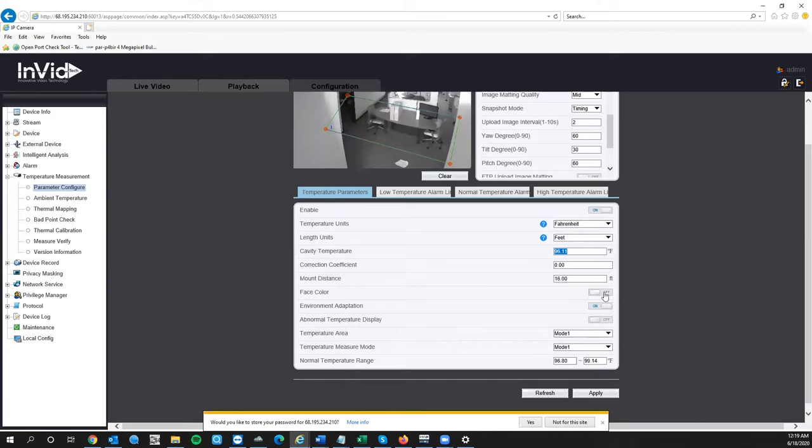Face Color will show color in the thermal lens — when someone walks in you'll see color on the face indicating heat levels. You might want to turn that on. Normal Temperature Display shows low temperature readings — we recommend leaving this off. Anybody showing lower than 96.8°F probably isn't walking around with that skin temperature. Showing low temperatures just results in misfires and confusing screenshots in the CMS with abnormal readings — it's not worth it.